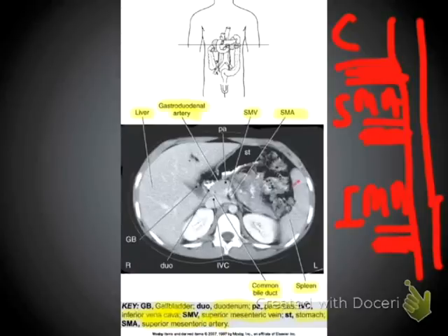I know that it labels the gallbladder, but I feel that that is the gallbladder here being a little difficult to really discern. We really don't know whether this is the gallbladder or not because we're not seeing it in a full field of view. So if we go down a couple more slices, we would actually see that this is probably the gallbladder, but we can't be really sure. So I don't expect you to know on this image the gallbladder. And once again, if on the exam I ask you a question, I'll make sure that I give you an ample chance to actually get the question right. It won't be something that's kind of thrown out and made extremely difficult, so difficult that there's no way that you can get the right answer.